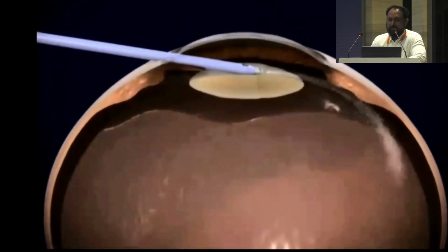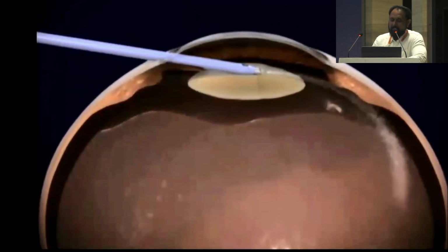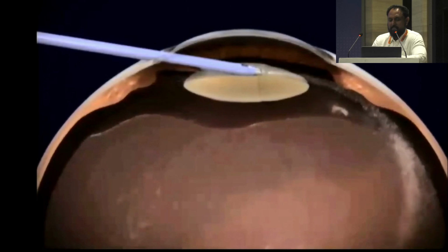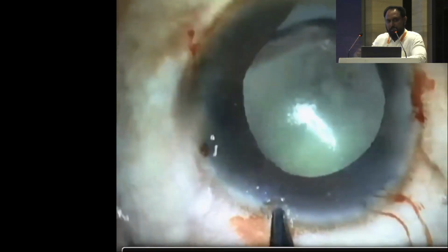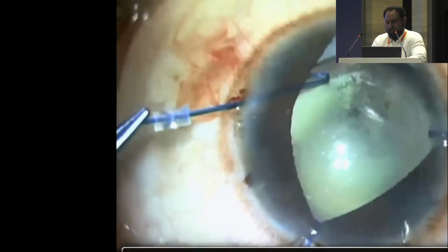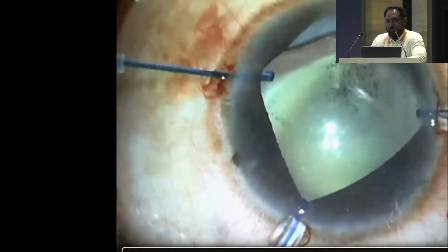Because most of the times when we have a ZD case, when you're doing phacoemulsification, some amount of the saline goes back and hydrates the vitreous, and then the vitreous actually moves forward, and that is the reason sometimes in the middle of the surgery you find that the AC is collapsing, the iris starts to shrink, or the iris tries to come out through the section. So what they have published here, the Agarwal group, is doing a pars plana vitrectomy just to slightly debulk.